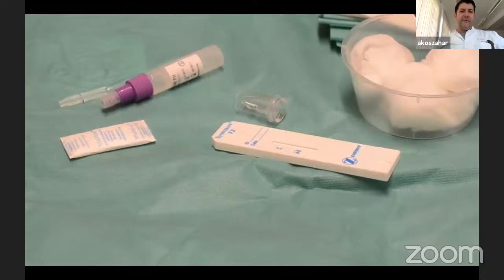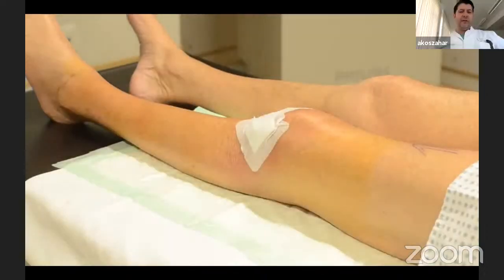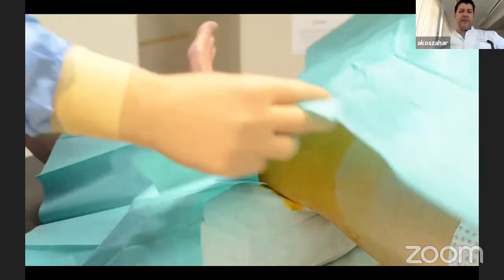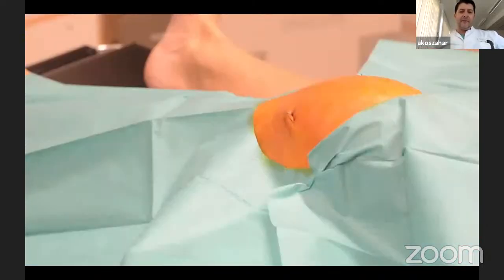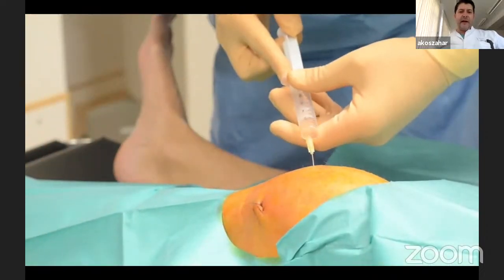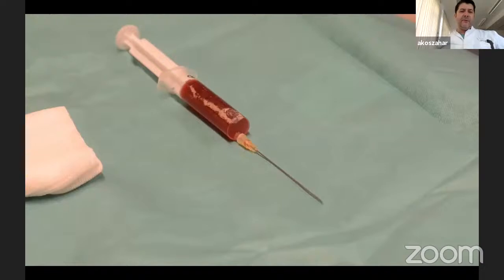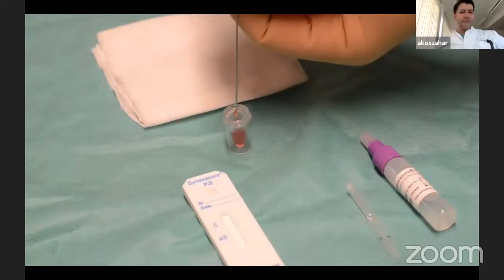This is a short video. Can you see the video? Yes, we can. Okay. So this is a short video about the aspiration. And we will show also how to use the Synovasure test, but it's not the most important thing in this video. It is more important to see how meticulous the surgeon works in order to avoid a contamination, with sterile prepping, sterile gown, sterile gloves, sterile syringe, of course, and to perform the aspiration in a sterile environment.